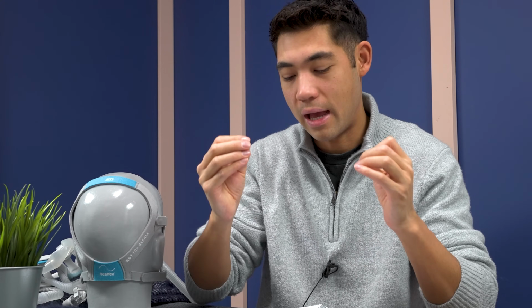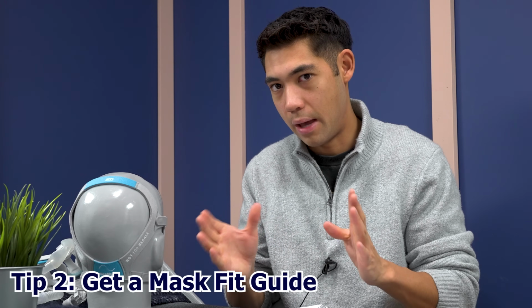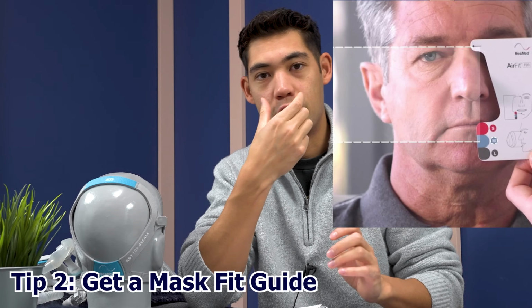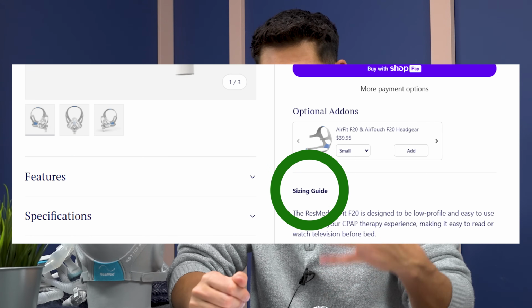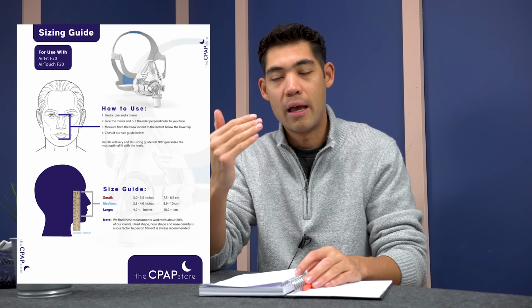Okay, the next thing is you wanna have a nice mask fit. Make sure you're getting the right fit. Every mask or mask fit pack, I guess, comes with a little card, okay? It looks like this, that you can put under your nose and your mouth and make sure that you're getting the right fit. If you don't have it and you don't know what mask to order, you can find our version of mask fit guides on our website under sizing guides. And when you do that, you can actually use a ruler, metric or imperial, to measure your nose and get the right mask fit. So that's available on our website.